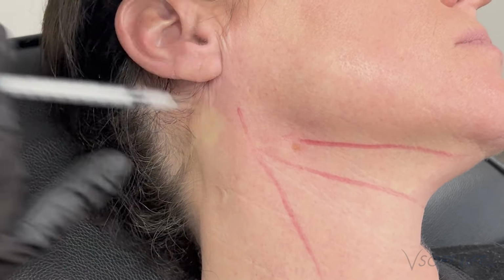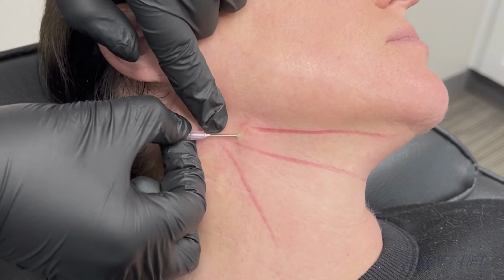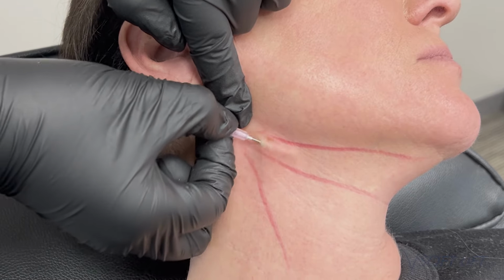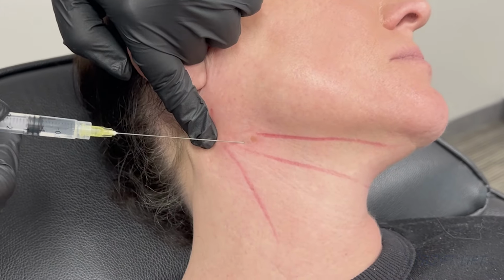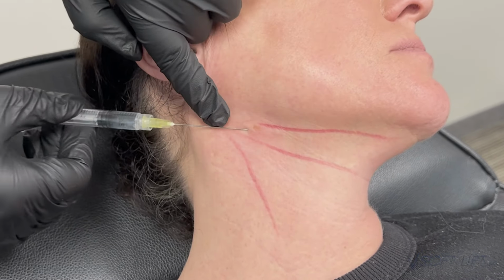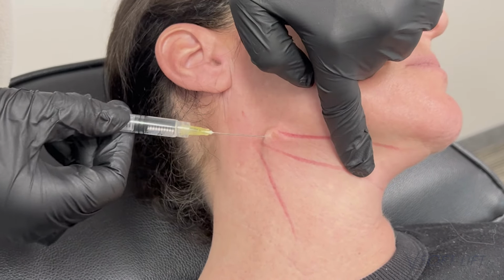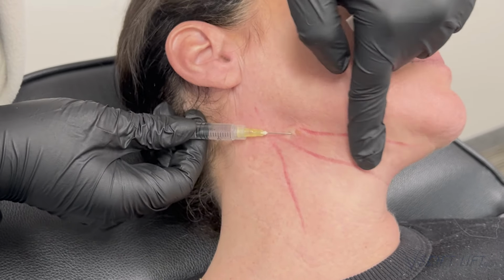She has some loose, lax tissue under the neck that bothers her, and it's not really that severe, so she's a really good candidate for this procedure. She's just kind of starting to get that laxity in the area here, and it's not really heavy tissue. It's also not heavy adipose or fat tissue. So it's kind of the best type of tissue to lift with lifting threads.